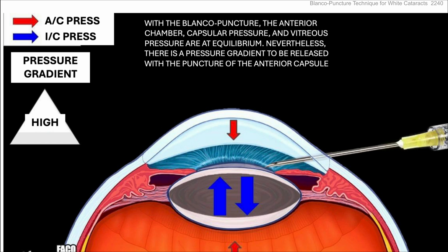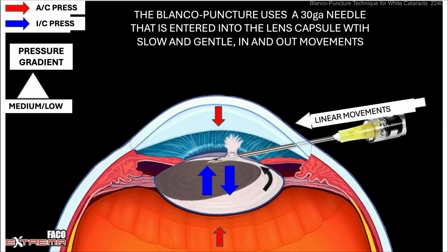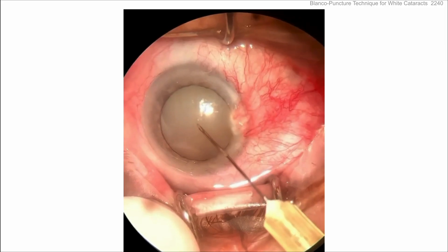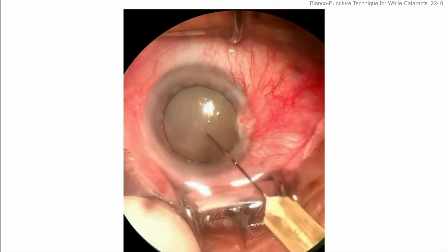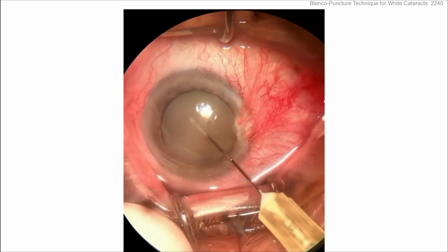Nevertheless, there is still a pressure gradient to be released when you puncture the anterior lens capsule — think of the balloon example again. He wants you to do a linear puncture in and out, get the nucleus rocked, and get the liquefied lens cortex from all around the nucleus out. In the video, you can see the milk comes out as he punctures in again — in and out, not left to right — allowing all that fluid to come out. You may also want to rock the nucleus a little bit.